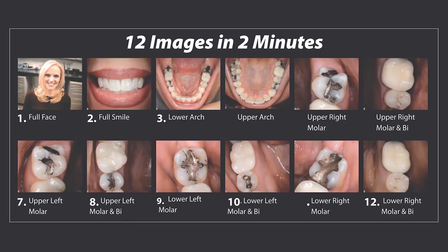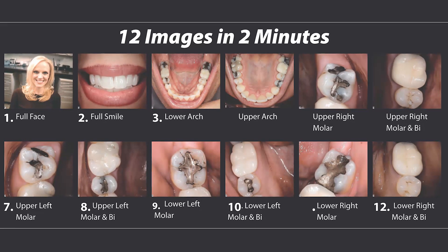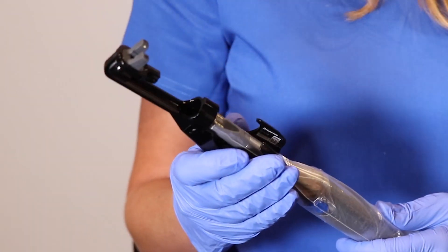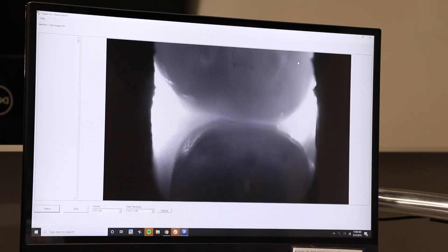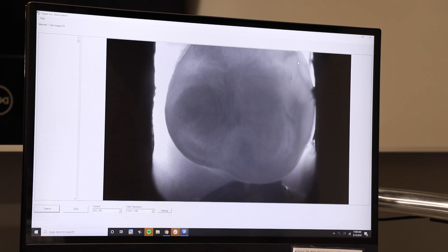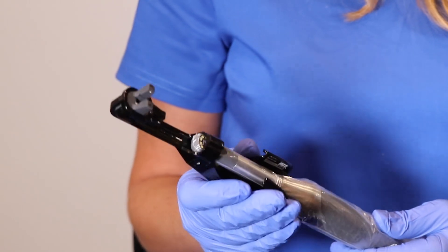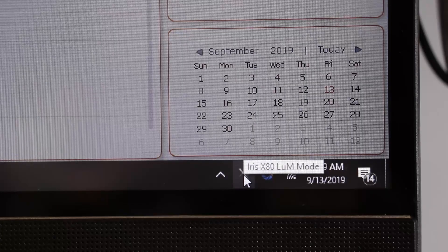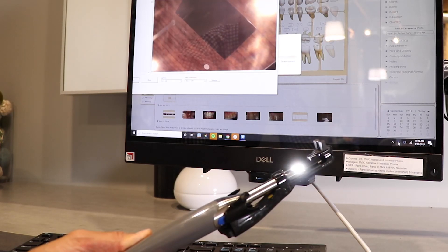When to take loom images: most dental offices equip their hygienists with the loom. After taking the intraoral camera photos, they simply attach the loom, double-click the icon, and take a tour of the patient's mouth while in loom mode. Then they slide the loom back off of the camera, double-click that icon again, and the camera light will come back on and you'll be back in color mode.